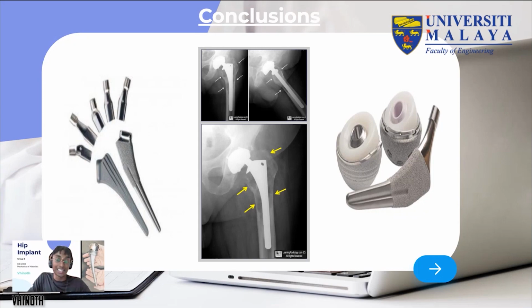There are more and more technical solutions to suit all femoral and acetabular shapes. In parallel, the recent understanding of hip biomechanics with regard to the dynamic relationship between the femur and acetabulum has altered our classical view of anatomy in these regions. These concepts present a challenge for each orthopedic surgeon and also biomedical engineers, and should be the central point in our future research regarding hip implants.